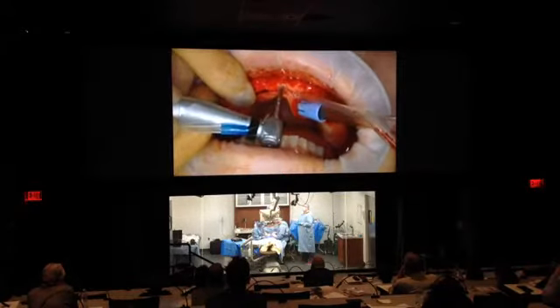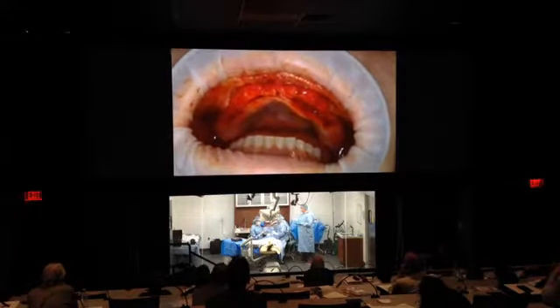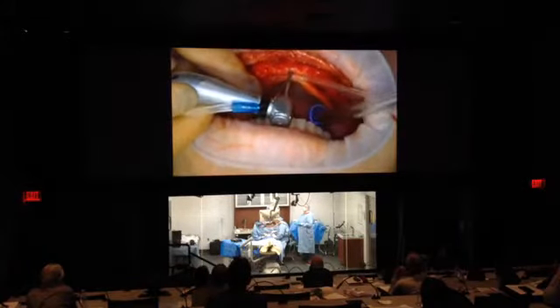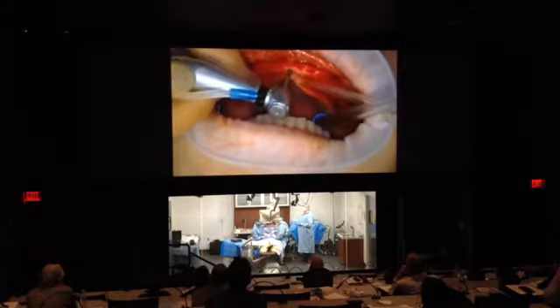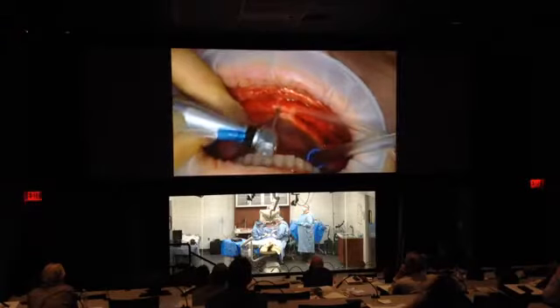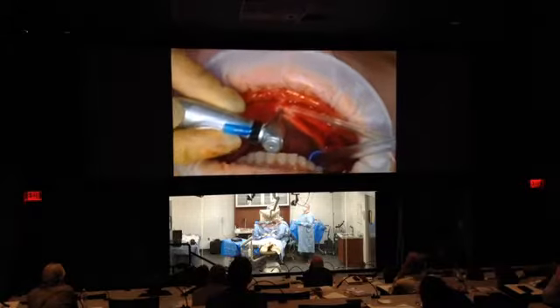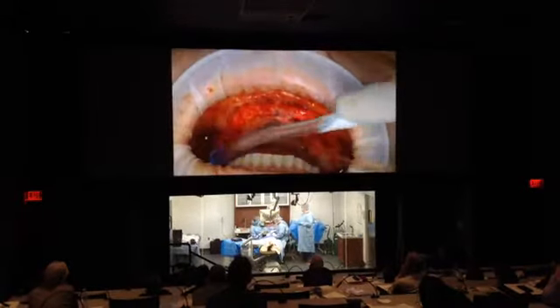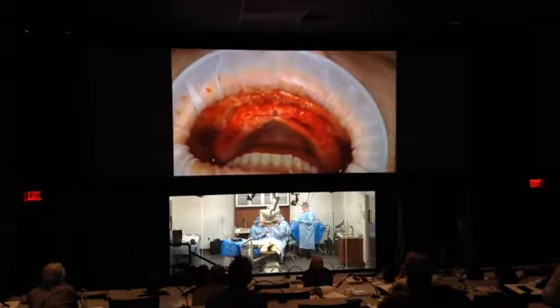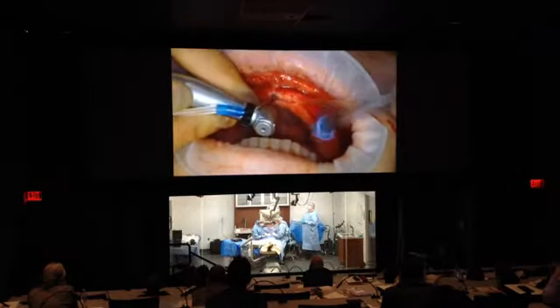Now see how this is skipping? So this is a good time to stop and pick up the precision drill, so I have a more precise point. You'll see the difference here in a minute. As soon as I put this on, it'll stay exactly where I'm drilling with it. And this again, it's right in the midline, so I could put on my surgical guide, or the All-on-4 guide. Now that I created an entrance, I can go back to the 2mm twist drill. And see, my drill doesn't skip anymore.